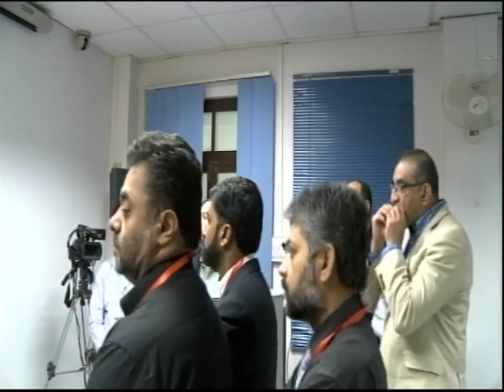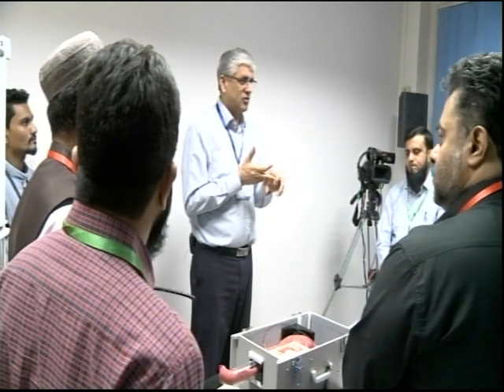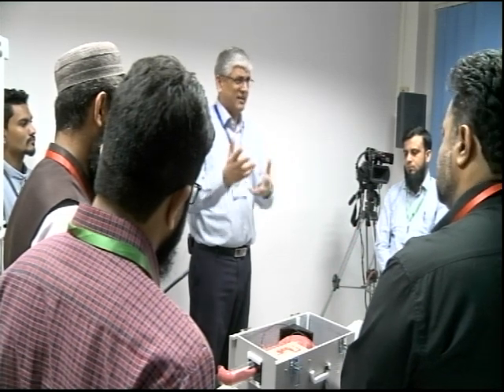Pancreatic cases, all pediatric cases, all repeat ERCPs. They are all done under propofol. Okay, so all the difficult ones, when I say that, I mean mainly pancreas divisum, pancreatitis, etc.